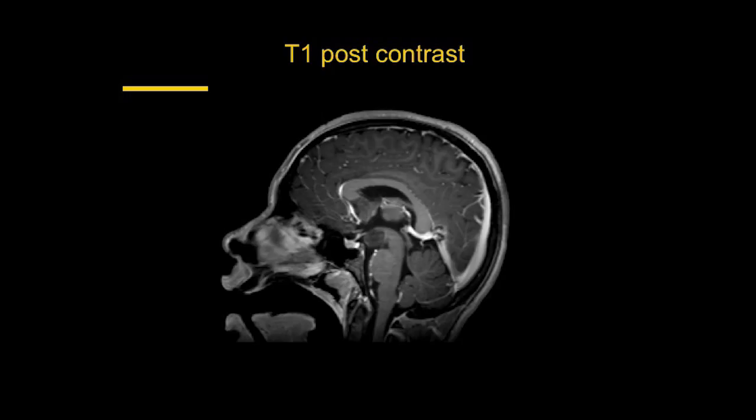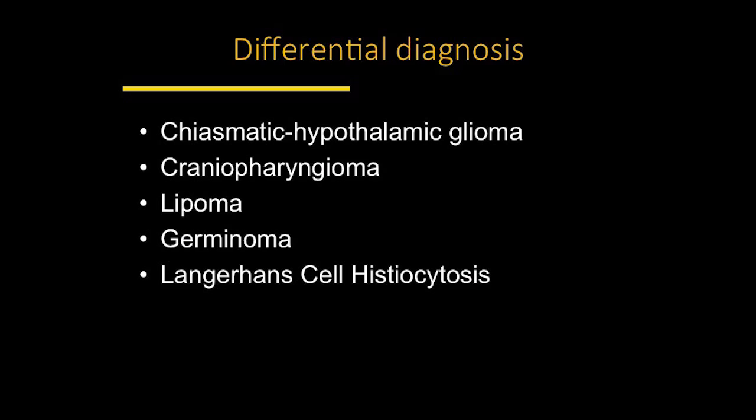On the post-contrast image, we see vessels and venous sinuses that are bright — confirming contrast is present. The pituitary gland enhances and becomes brighter, and the pituitary stalk also enhances. But the hamartoma in the hypothalamus does not enhance — this non-enhancement is the important characteristic that distinguishes it.